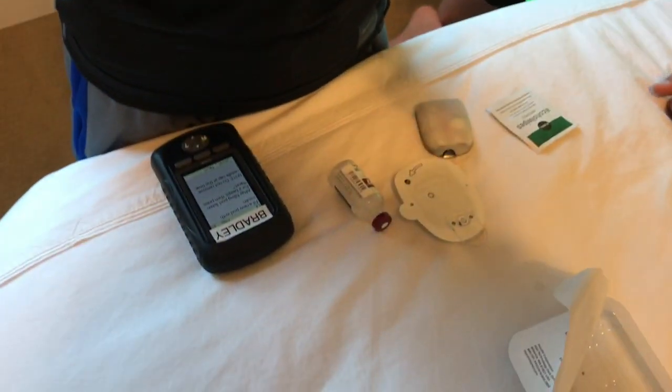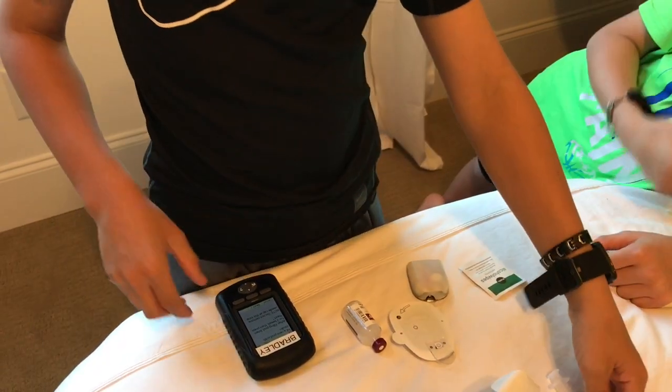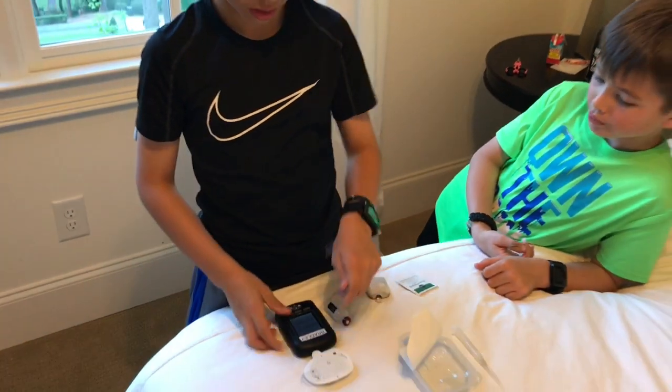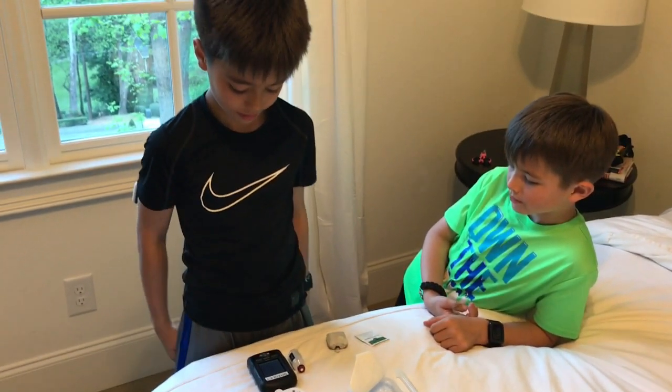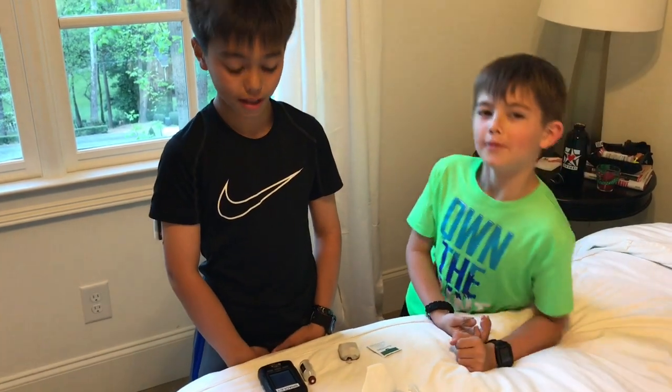Take the cap off and put it on the needle cap. Then press next. It will say priming — just wait a minute for it to finish.